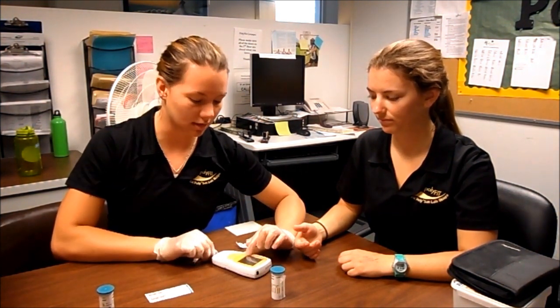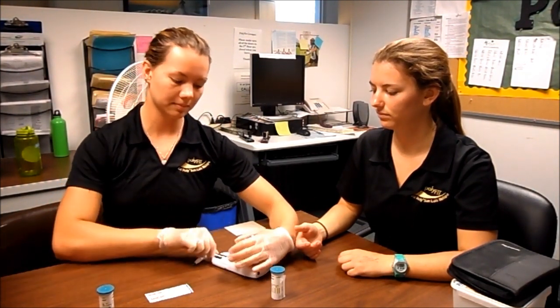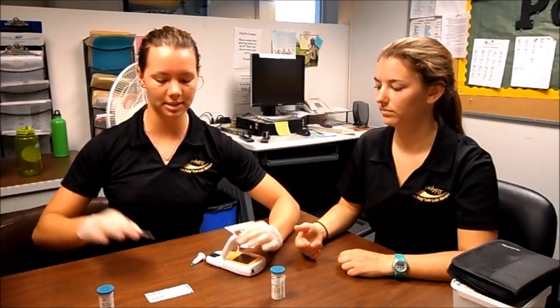Once the test is over, it will give you a reading. You can then open it up, take out the strip, and make sure you put it in your sharps container.